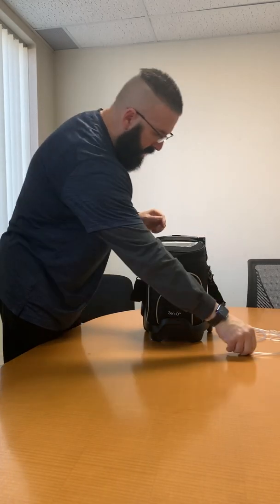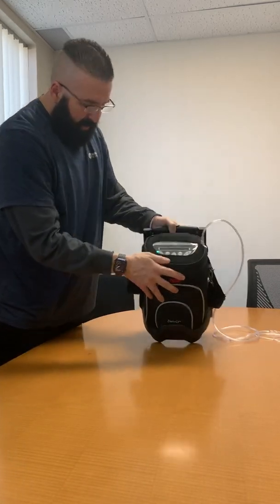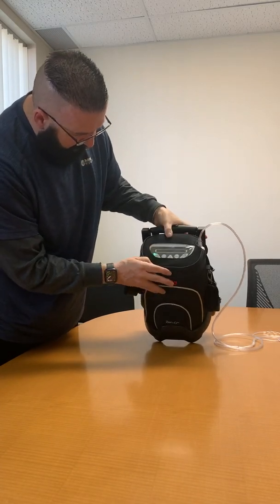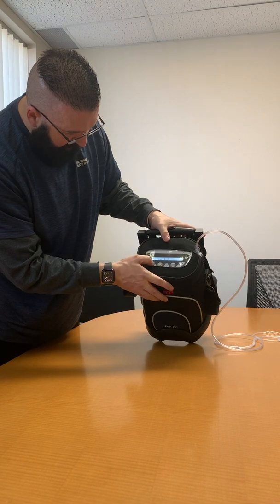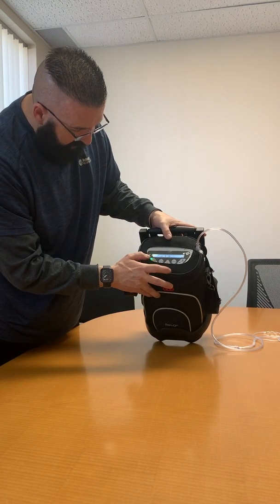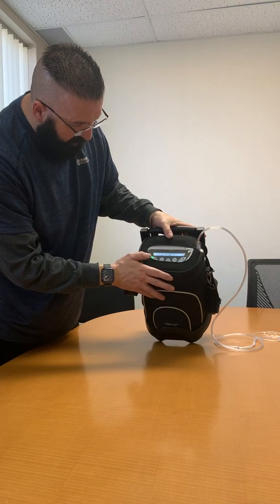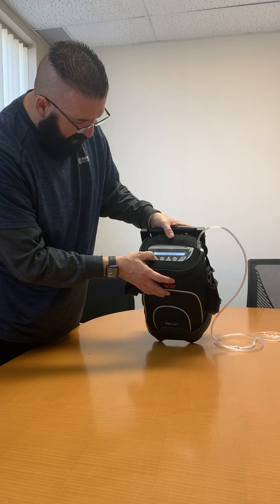this zips down to protect it. You can put your cannula right back on here. You can still see all your stuff in here. You can still do all your same functions through there inside. There is also an alarm on here that detects if you're not breathing or if there is something faulty going wrong with the unit. And we're just going to power it back down.